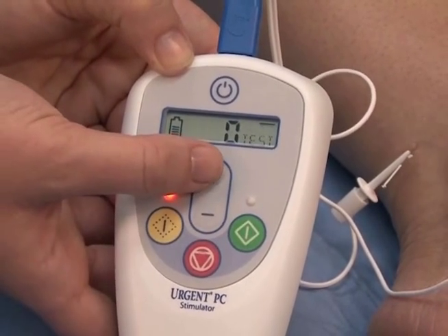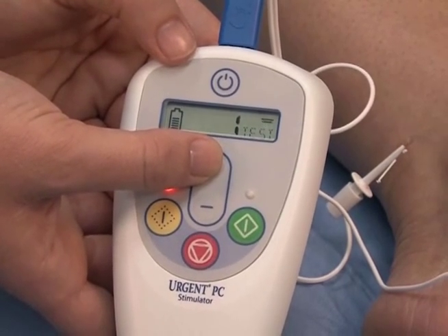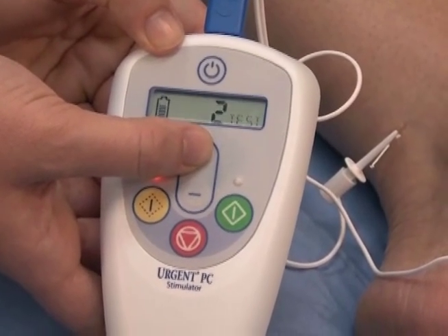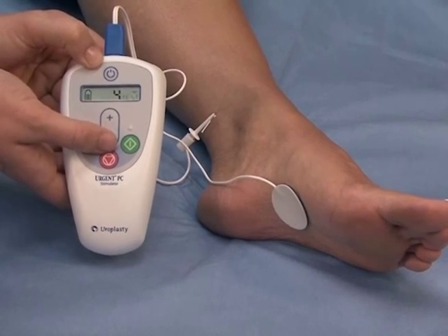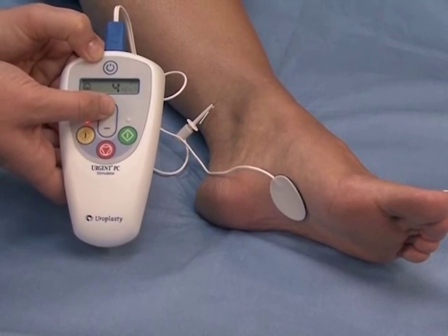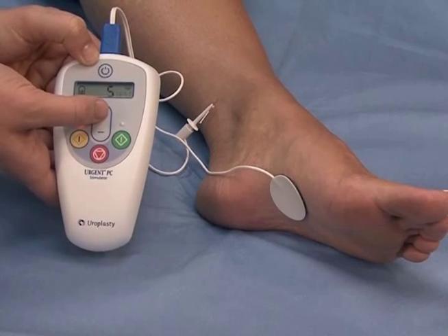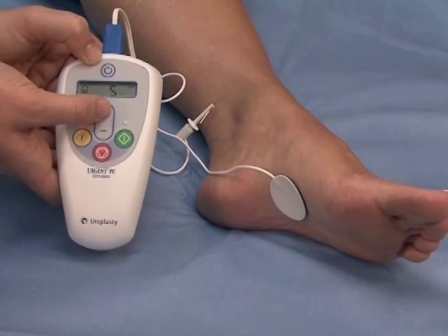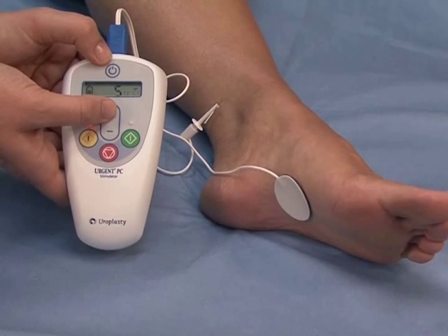The clinician will turn on the stimulator and slowly increase the impulses. They will ask what the patient is feeling and watch for involuntary toe movement. Toes may flex or fan in response to the stimulation, or the patient may feel sensation in the heel, bottom of the foot, or up the leg. If there is no response, the clinician may adjust the needle or stimulator or try the other ankle.